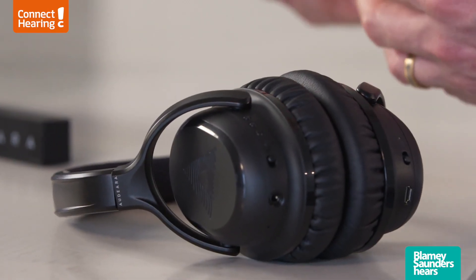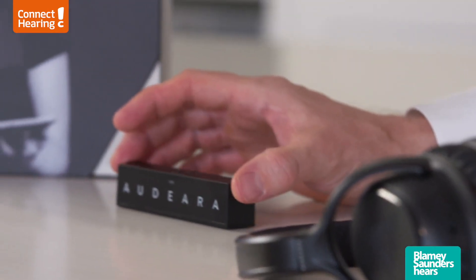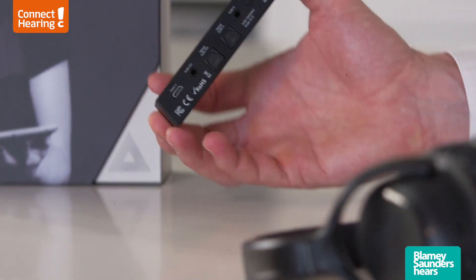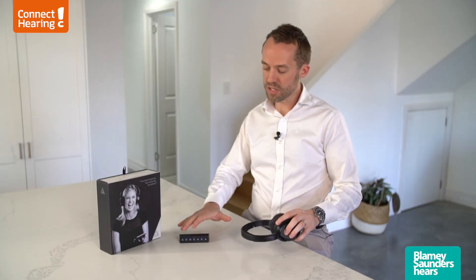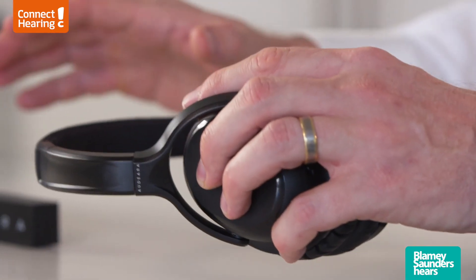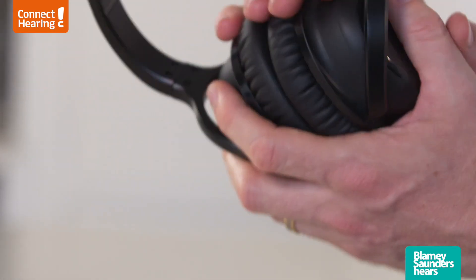If you're looking to pair these to your television you'd use the wireless audio transmitter. There are two cables that come out of the base — the first would go into the back of the TV and the second would go into power. The headphones then pair wirelessly to this so that the sound will stream directly from the television into your ears.